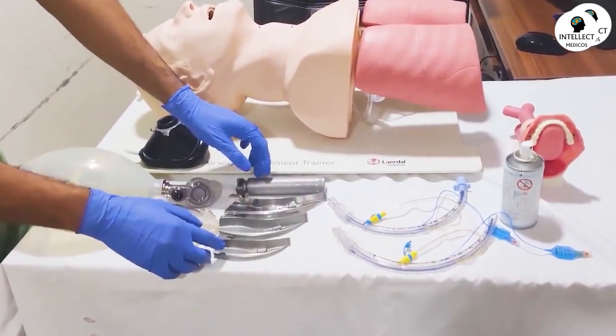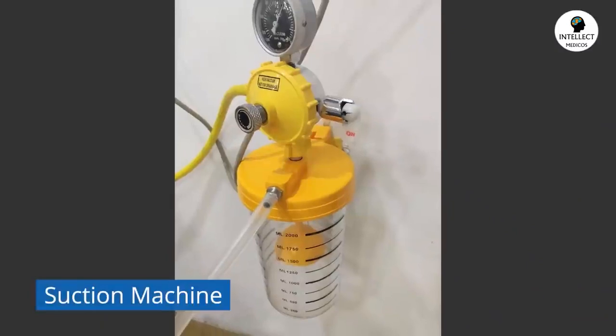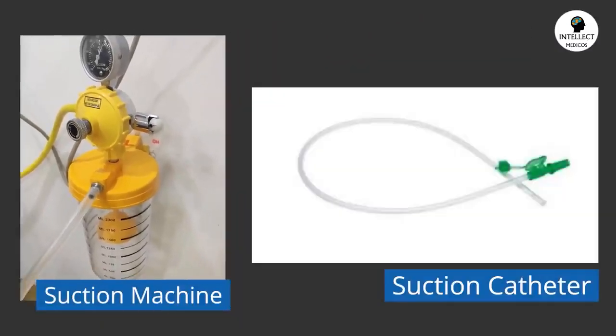Along with these equipments, you need to have a properly functioning suction machine and a suction catheter. Now, if you suspect there can be difficulty intubating, that means there is a difficult airway, then you need to prepare a cart that is called the difficult airway cart.